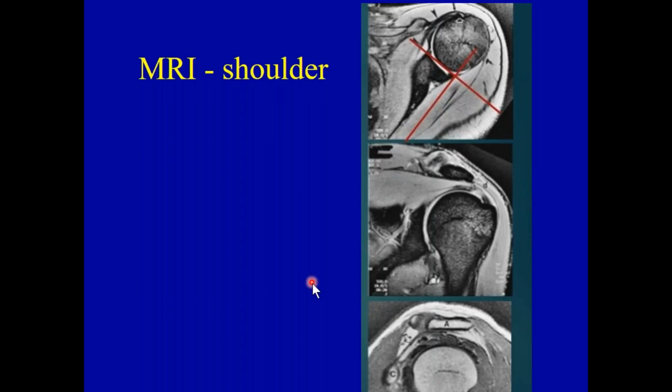Well, this MRI will certainly give us more information, that's absolutely true, but the technical component on an MRI is anywhere from $500 to $1,000, just to give you a basis of comparison. The value of the MRI is that I can see so much more anatomic detail. So just to give you a comparison, this is still the humeral head, this is still the scapula, but now we can see it in different perspectives.